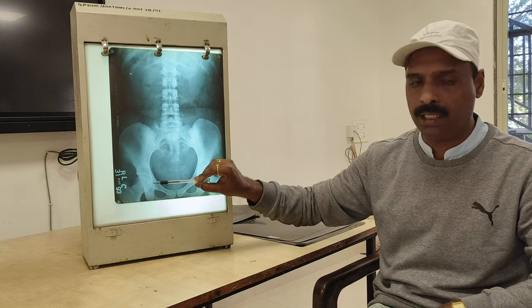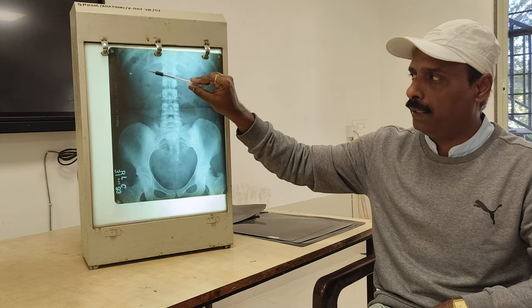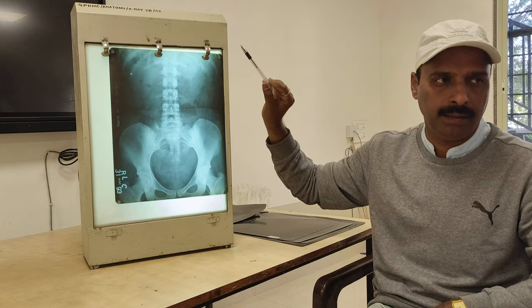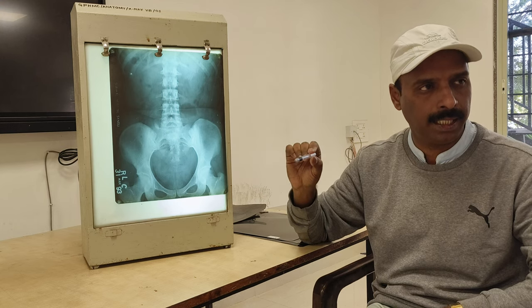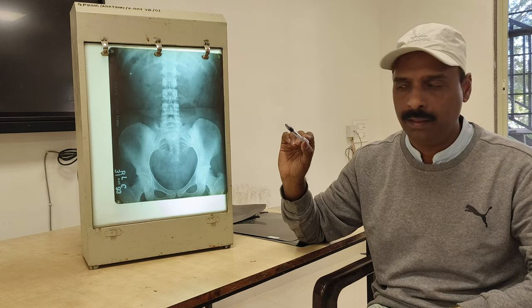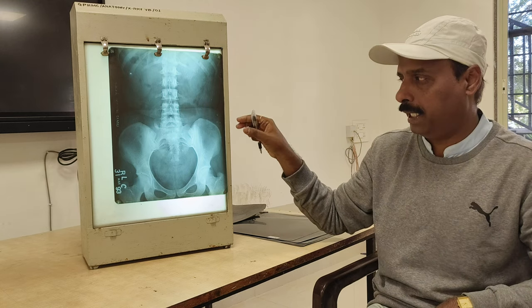Obturator foramen, pubic symphysis, pelvic inlet, sacrum, coccyx we are going to see. And the hip joint also you are going to see, and the lumbar vertebrae. In this region, shadows of the kidneys we get, and the lower part of the rib cage is seen. So this is a plain variety of x-ray, which we call KUB: kidney, ureter, urinary bladder.